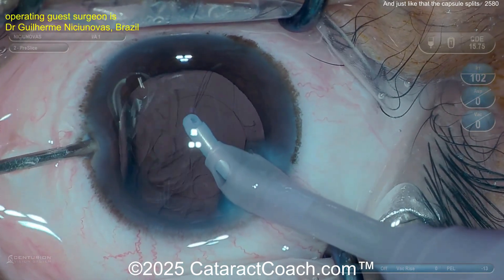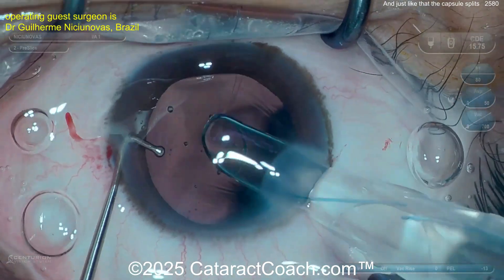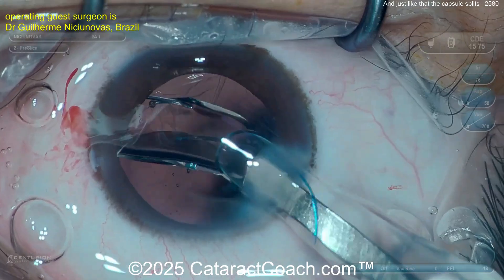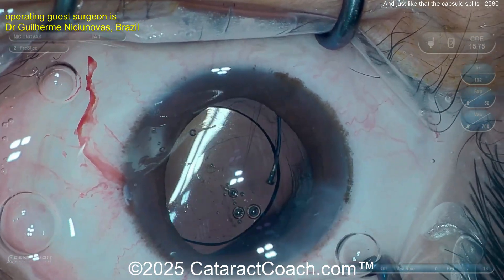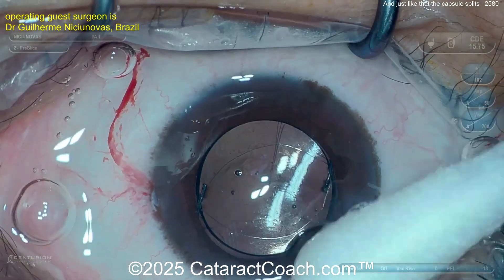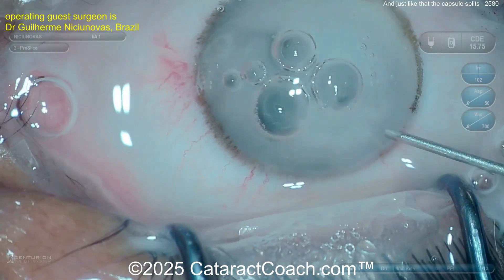Now what do you do? Stay on position one, keep the infusion in the eye, inject viscoelastic, then you can come out of the eye. With a three-piece lens, you probably have an intact anterior hyaloid face. Get that lens in — you're going to have haptics in the sulcus with the optic captured behind the rhexis. That gives you great long-term stability.